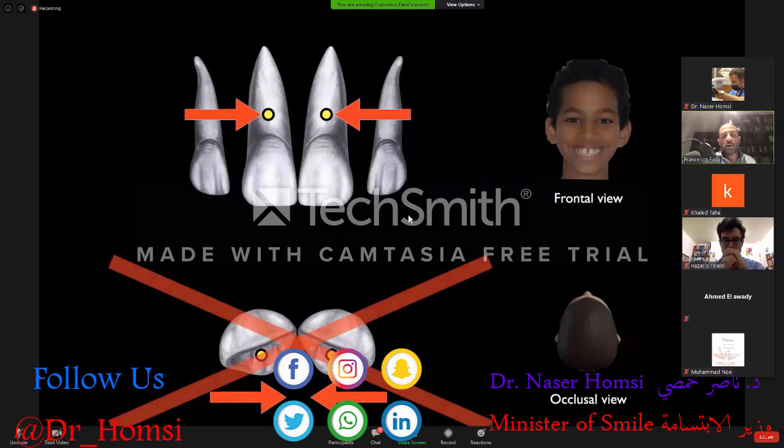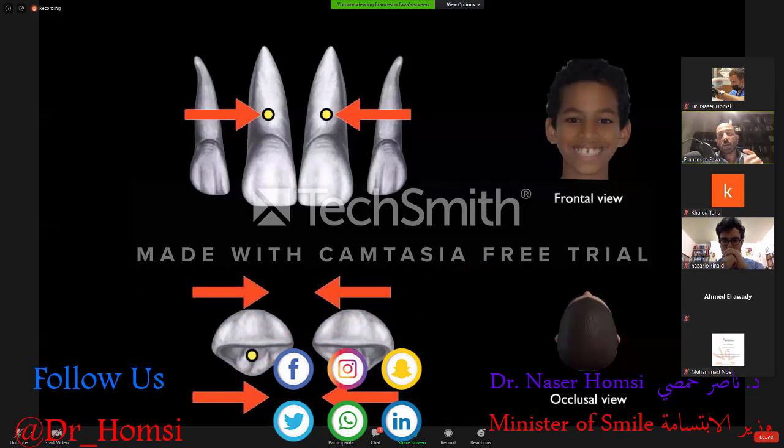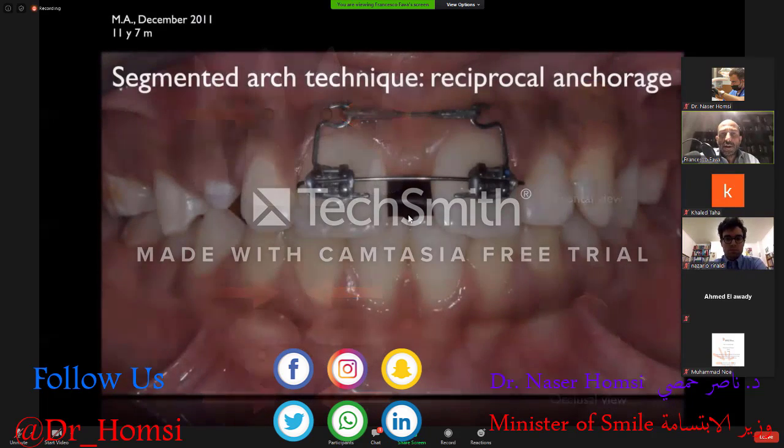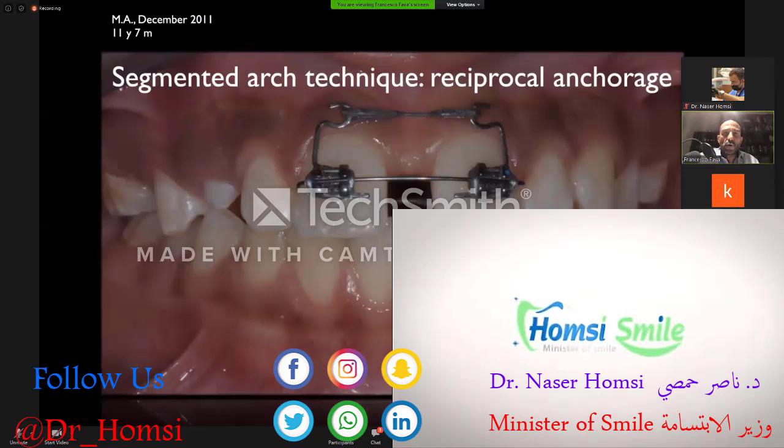The solution we decide to use is to apply a force both on the palatal as well as the buccal side, creating a so-called double cable mechanics, which means applying forces on both sides of a tooth to prevent undesired rotation. And this is what we decided to do. Very easy case for Mohamed.